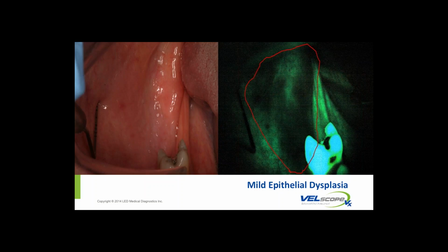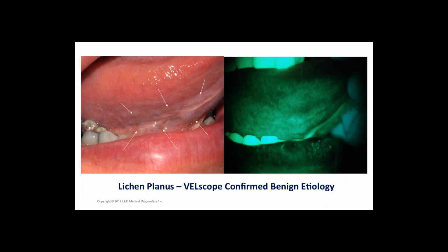The other thing is looking at the left, we don't really see anything. Unfortunately, changes could eventually occur that wouldn't be apparent until it's already too late. So again, another way of utilizing this as a management tool for your patients. And a lot of things are going to show up as green or light green that tells us it's benign. Again, it doesn't mean we ignore it. Always have a diagnosis because obviously you're going to treat different things differently. But from that, again, this reinforces at least a benign state.